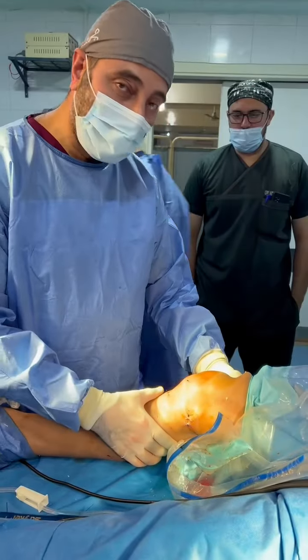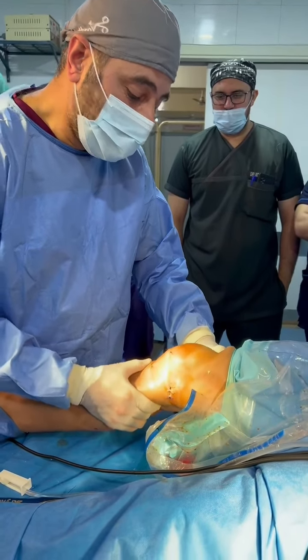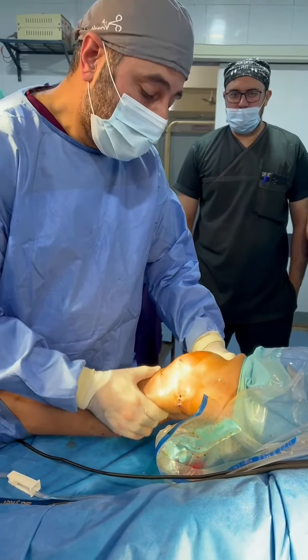So you can see that now after ACL reconstruction, the stability is restored and Lachman is negative now. The knee is stabilized arthroscopically.